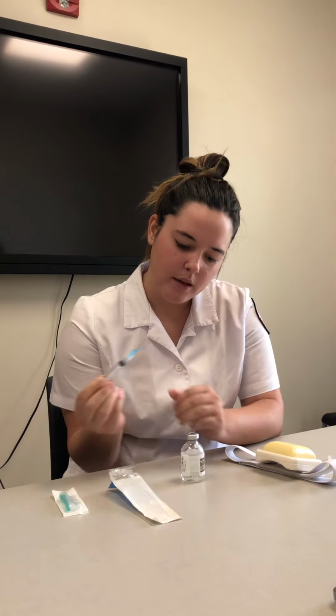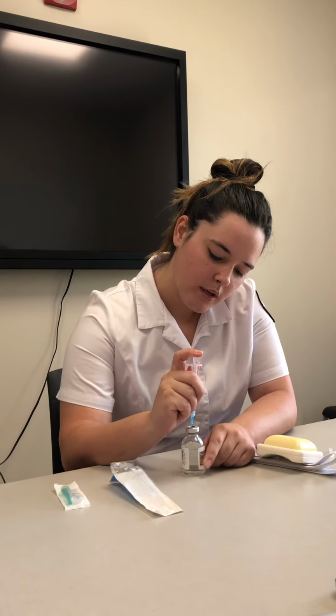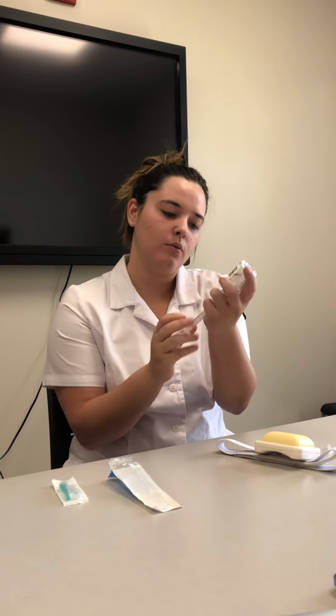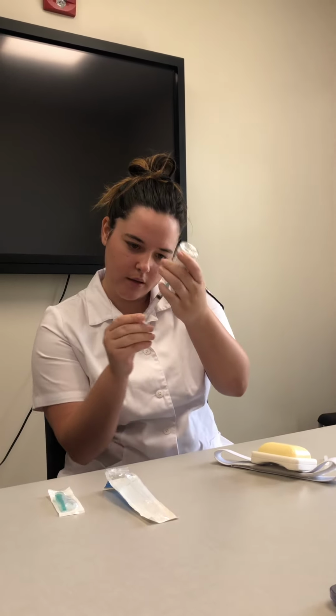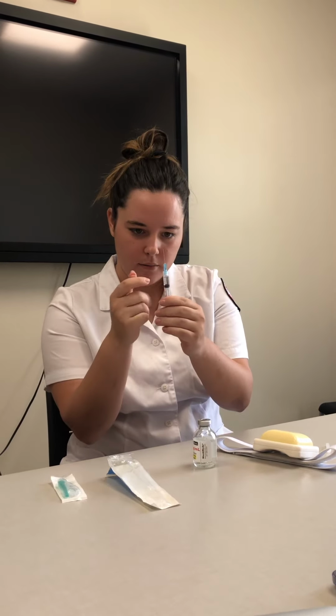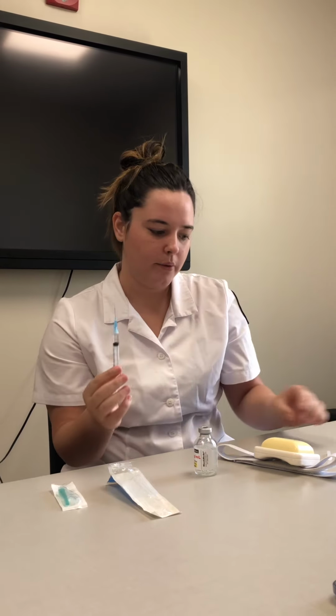Okay, and then we would put the air into the vial and immediately withdraw 0.8 milliliters of Haldol. Okay, so once we get that, make sure there's no air bubbles, and then we would recap.